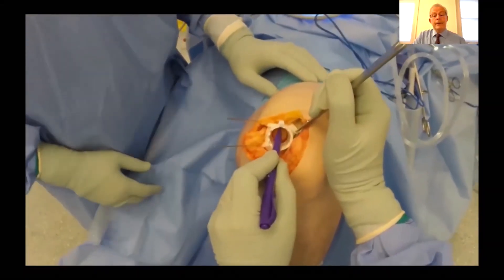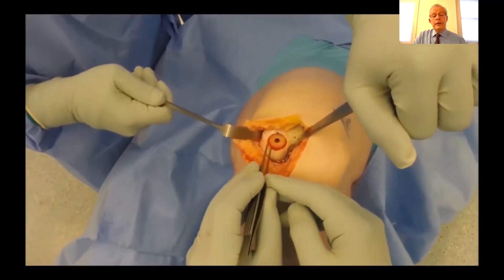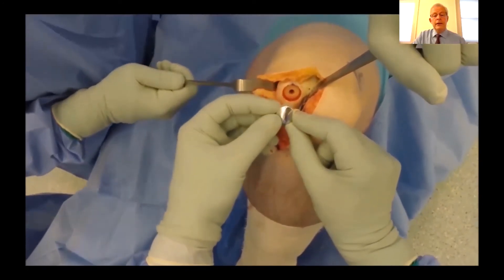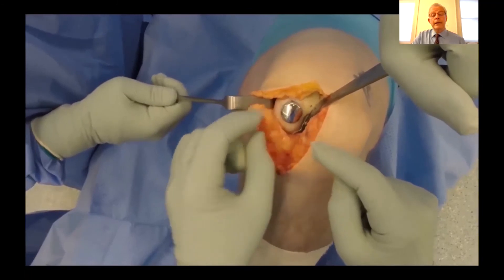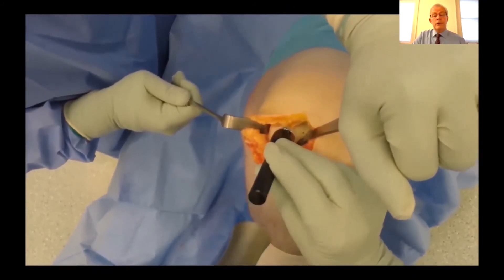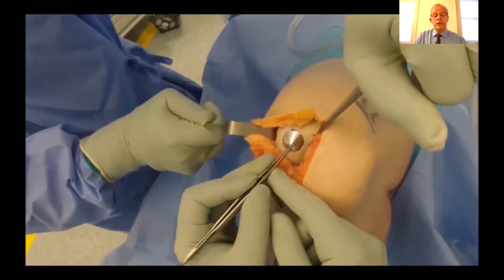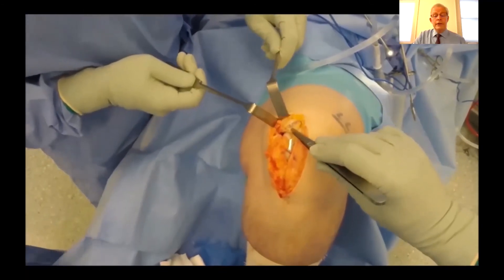An arthroscope can be used to verify the implant sits half a millimetre below the joint surface. The top of the site is marked and a small indent on the EpiDummy is aligned to confirm correct position. After a final check confirming the half-millimetre depth, the actual implant is inserted using the EpiMandrel to gently impact it into place. The implant then fully covers the defect according to the pre-operative plan. Closure is performed with staples or subcuticular sutures, the tourniquet is released, and the sub-vastus layer is closed.